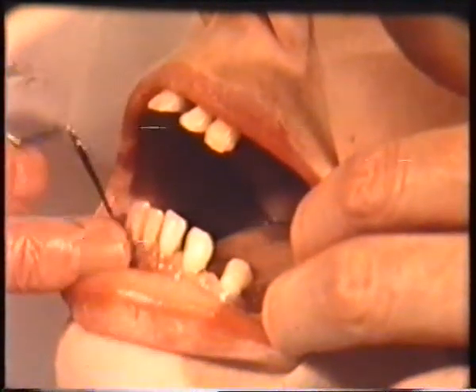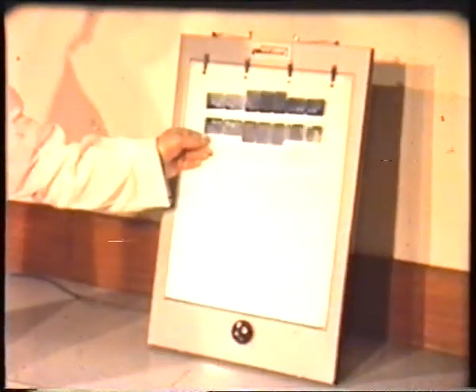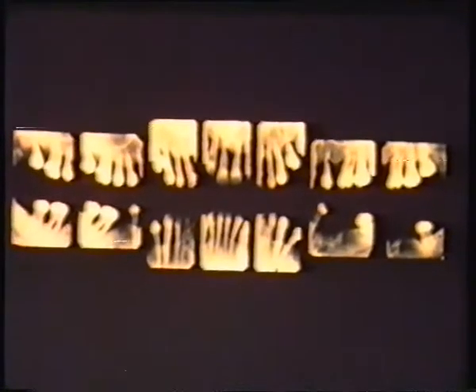To obtain a final assessment of the condition, pocket depth measurement should be combined with inspection of the radiographs of the anterior teeth. It will be seen that bone has been lost to such an extent that only the apical third of the roots of the teeth are held in bone.